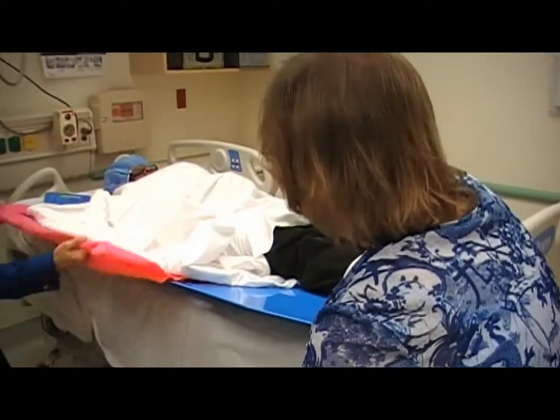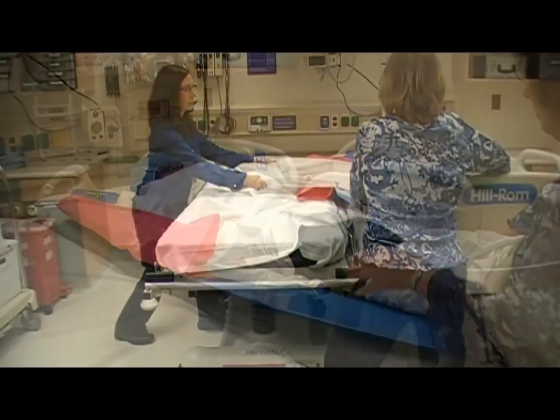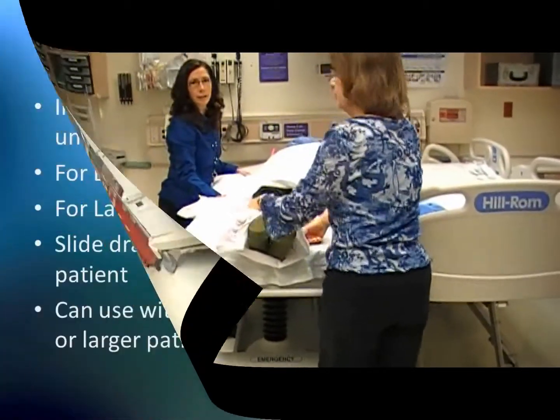When ready to transfer the patient, pull the draw sheet by moving your arms closer to your body and shifting your weight to the back leg.